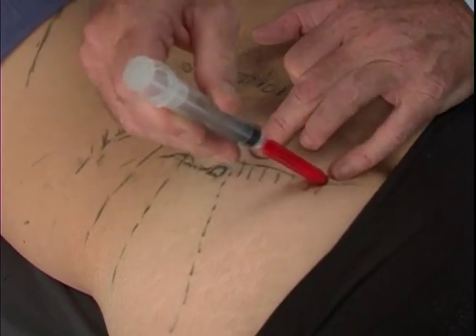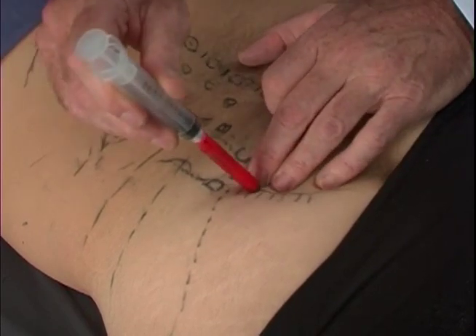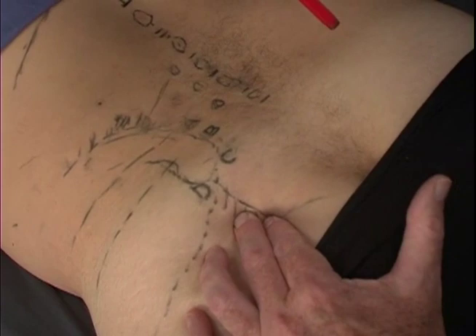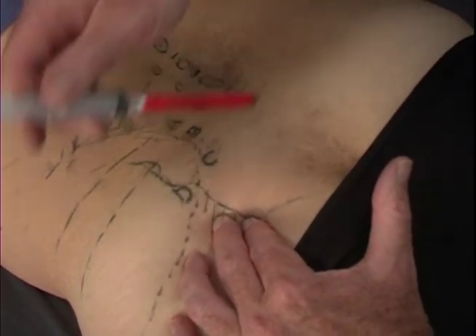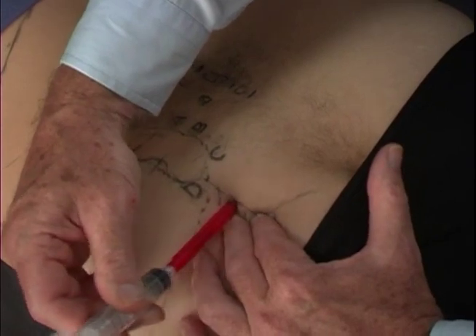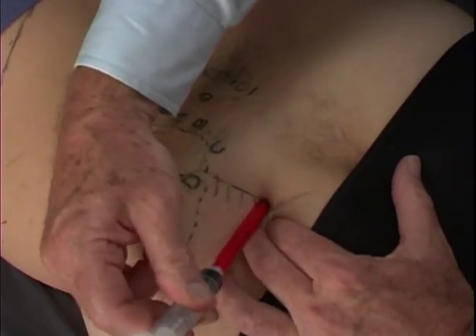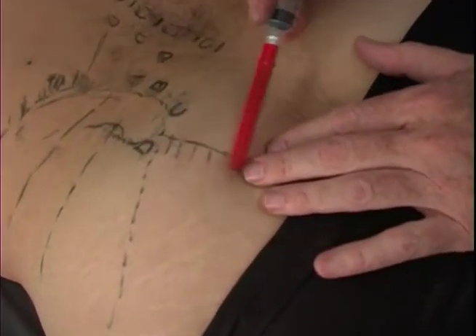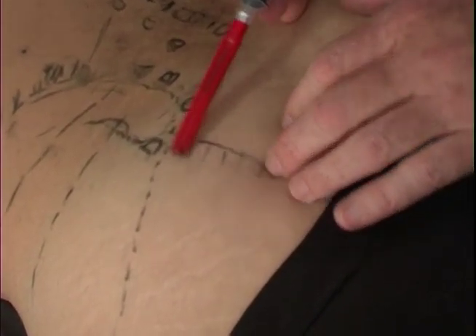It doesn't do us any good to inject on the top of the sacrum here. We want to be right at the edge. The other thing to do with this is to really push the tissue in very, very firmly and come in from a lateral direction, getting on the lateral border of the sacrum as we walk down in the attachments of the sacrospinous and sacrotuberous ligament in this area.